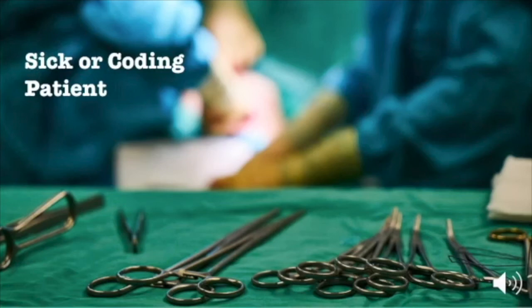Step 1, check your own pulse. Make sure you're not also in VTach. Although this situation sounds scary, you can take a deep breath and relax. This isn't going to be much different than a normal code. Next, if the patient is unstable with an arrhythmia, then you need to cardiovert them just like you would with any other unstable arrhythmia. Make sure you do this per your department's protocols. There are, however, a couple of caveats when you're doing this with an LVAD. Caveat number 1, place the pads in an anterior and posterior configuration. And the second thing to remember is that it's recommended that you disconnect the LVAD from the controller very briefly while you do the actual cardioversion.